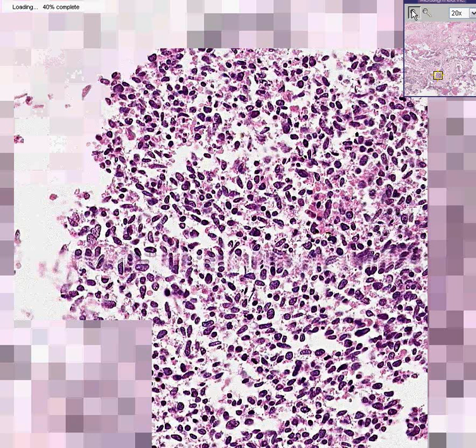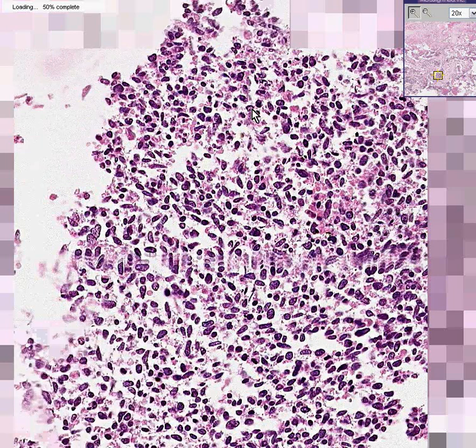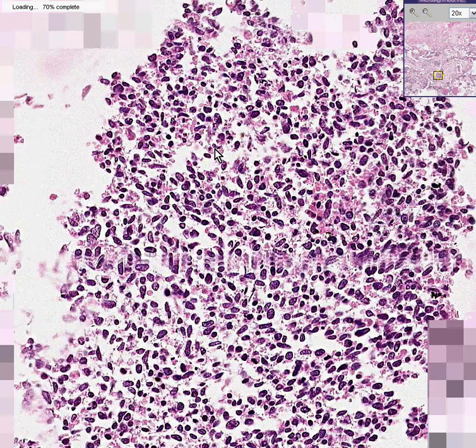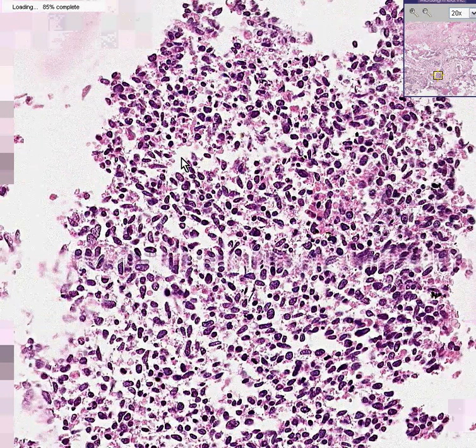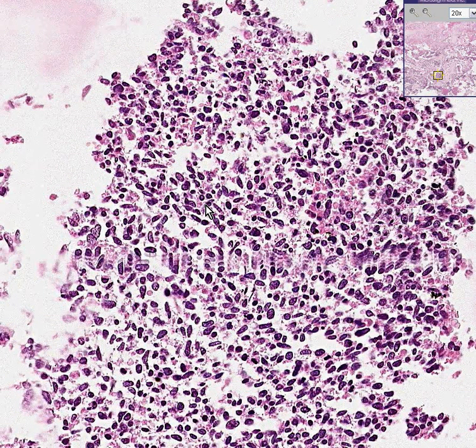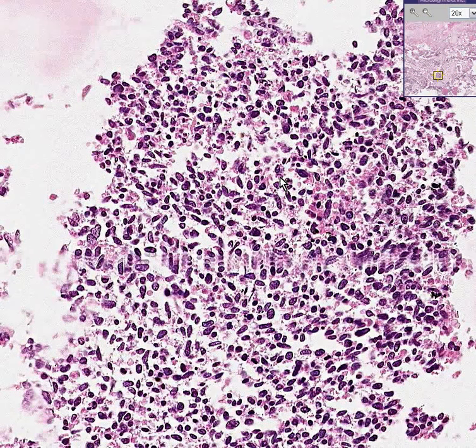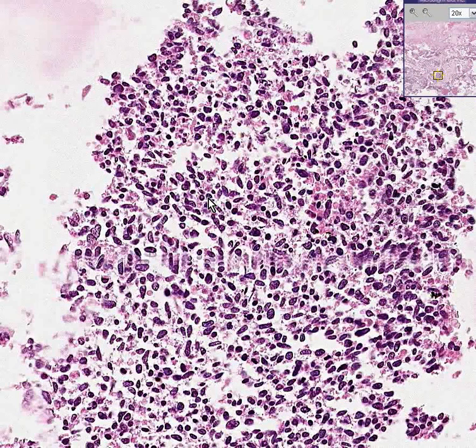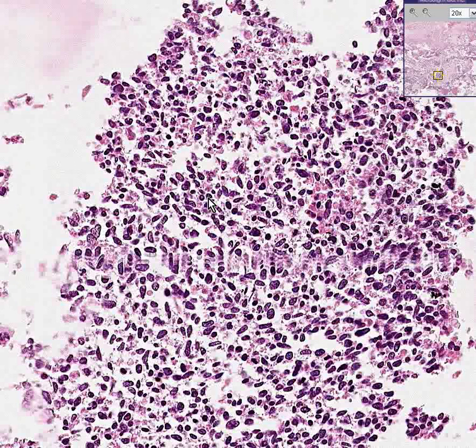Relatively small cells, no glandular formation, very minimal cytoplasm, very densely staining. You don't see many nucleoli here — the whole nucleus looks as dense as a nucleolus. This is small cell carcinoma, and thank you once again very much.